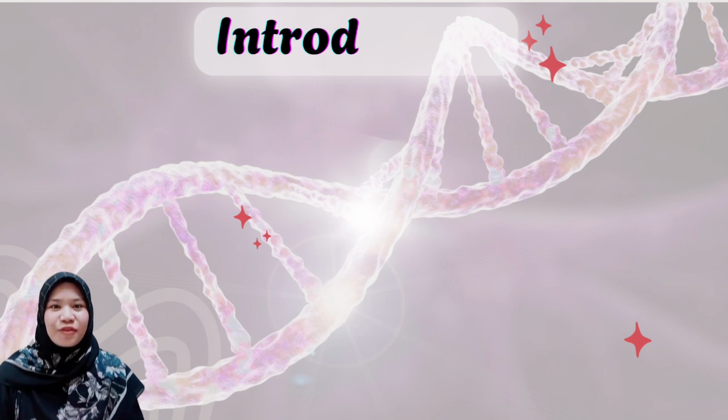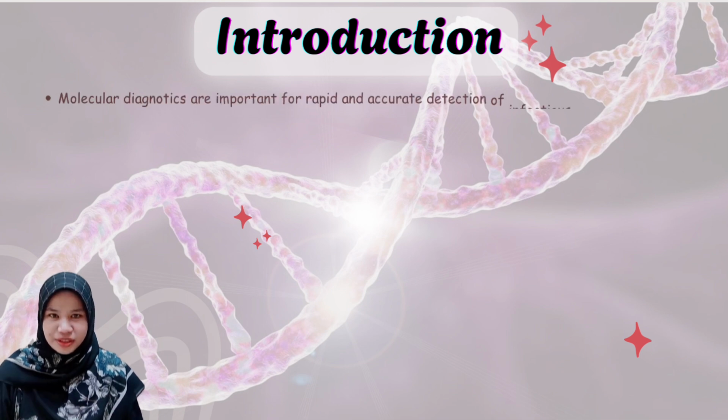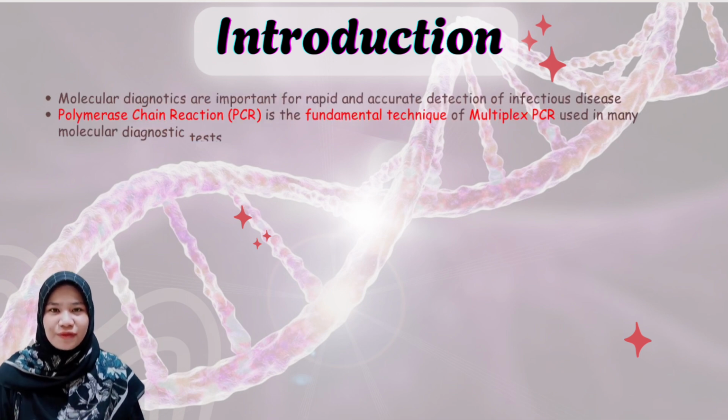Start with the introduction of multiplex PCR and molecular diagnostic panels in infectious disease testing. Molecular diagnostics are important for rapid and accurate detection of infectious disease. Polymerase chain reaction, or PCR, is the fundamental technique of multiplex PCR, which is used in many molecular diagnostic tests.